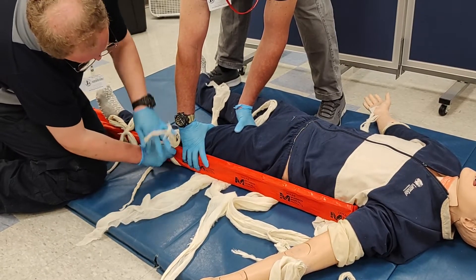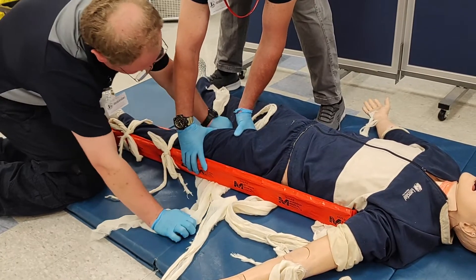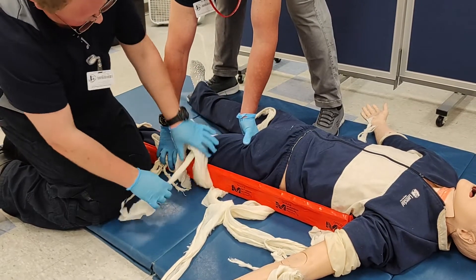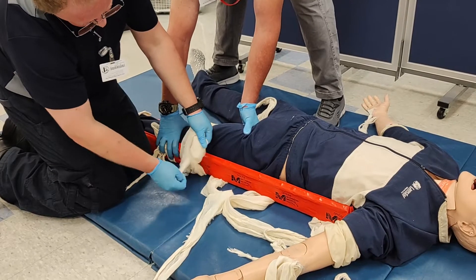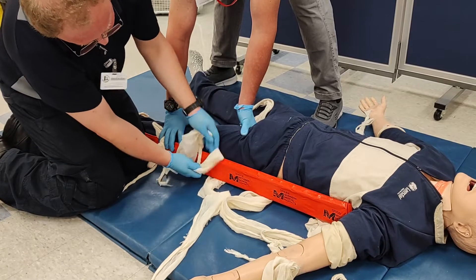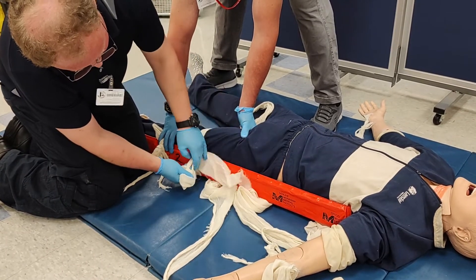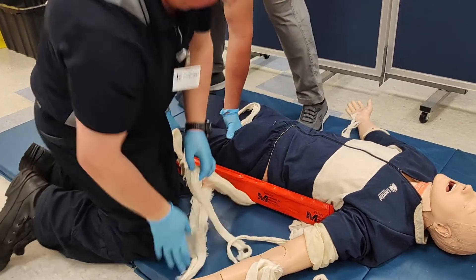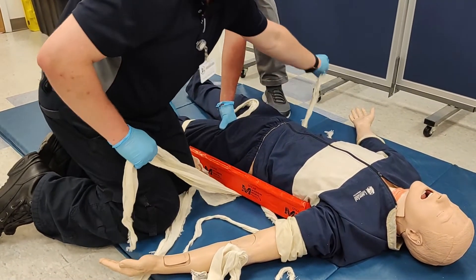Move systematically as you tie your cravats, ensuring you get the splints tight while respecting the patient's injury. If a particular cravat can't be tied due to the location of the injury, simply omit it and do your best to find a substitute location.